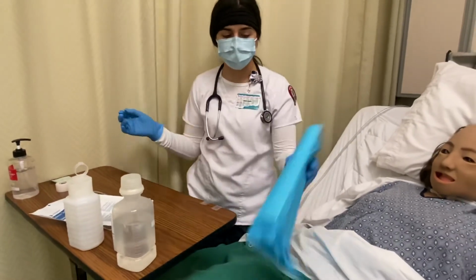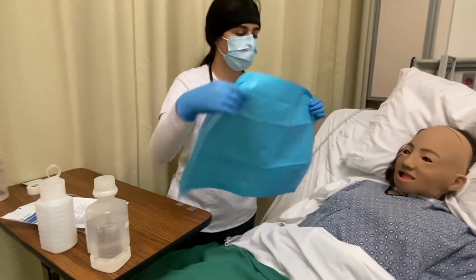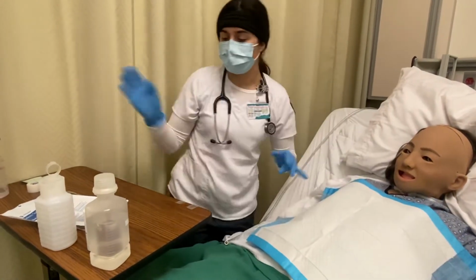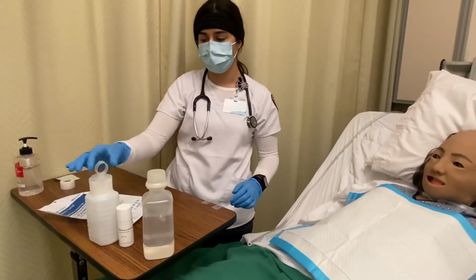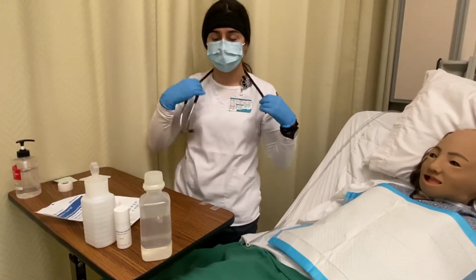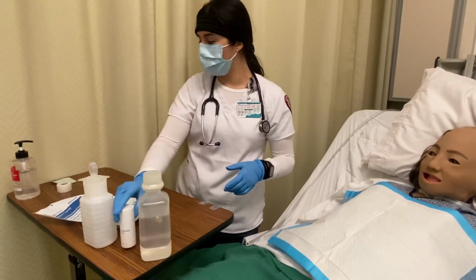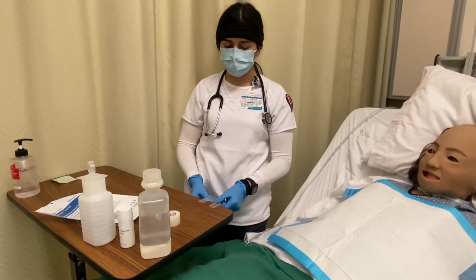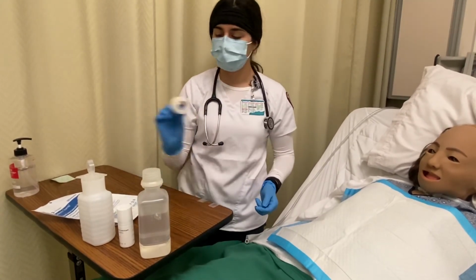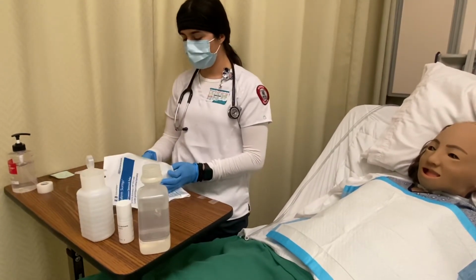Then I'm going to have my pad out, and I'm going to put it in front of the patient. I have my water cup, my syringe, stethoscope, and this is my lubricant. And then I'm going to have tape. I already have tape on the side right here that I had ready prior. So I'm going to go ahead and get my NG tube.